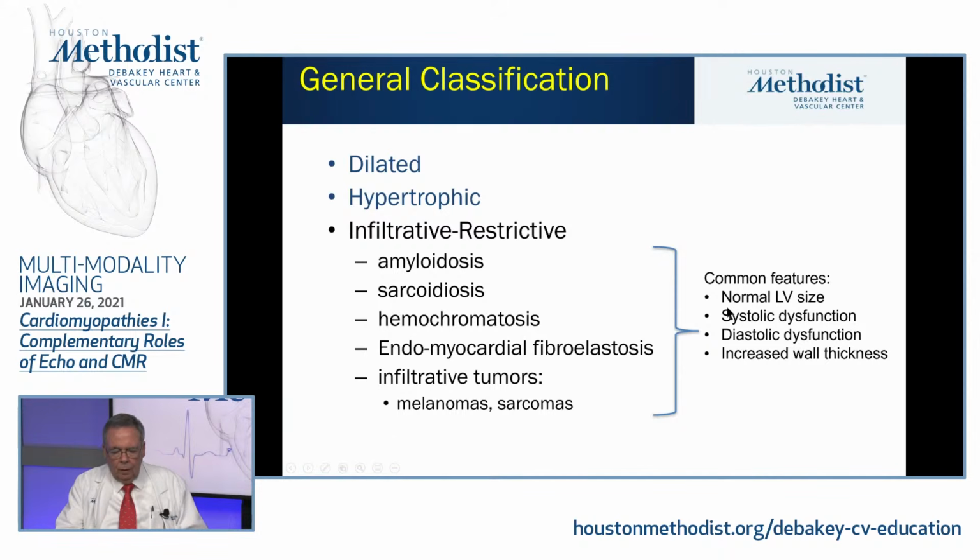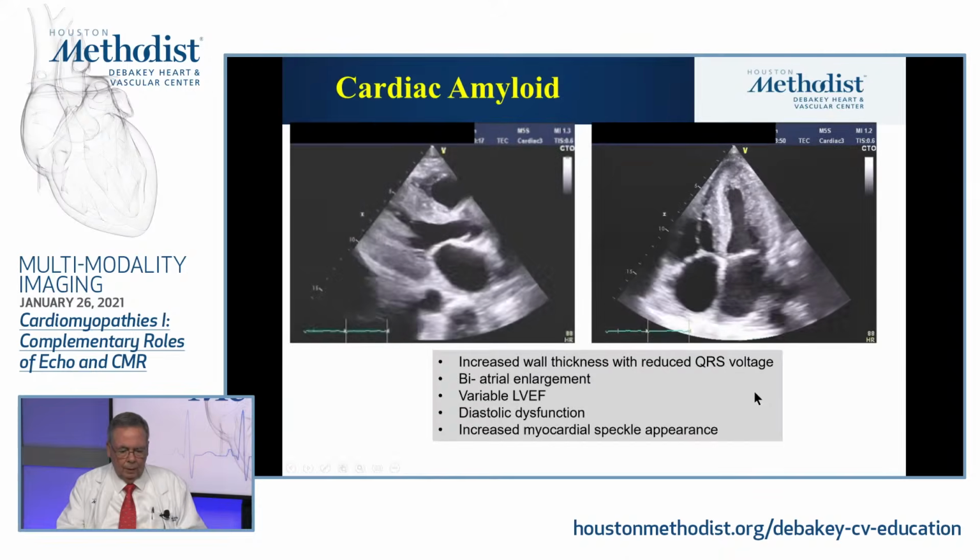And then of course, if you do diastology, often you may find that these patients are already in a restrictive phase of the diastolic dysfunction, but not always. They could be in the early phase of impaired relaxation with normal filling pressures. So you really have to be suspicious and think through it, because otherwise the patient may go through the echo lab and be missed.